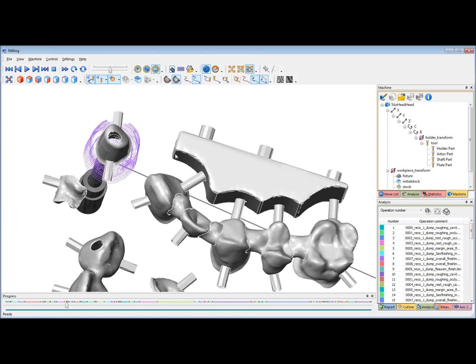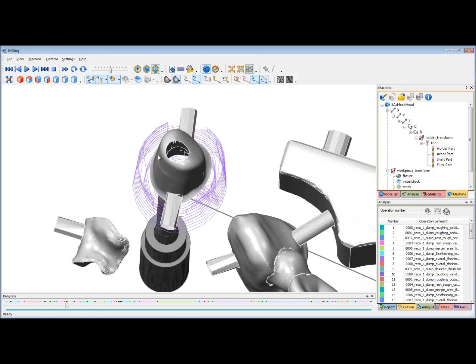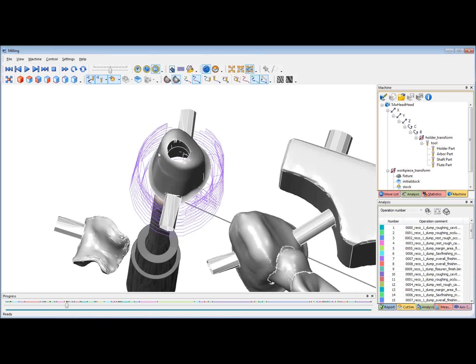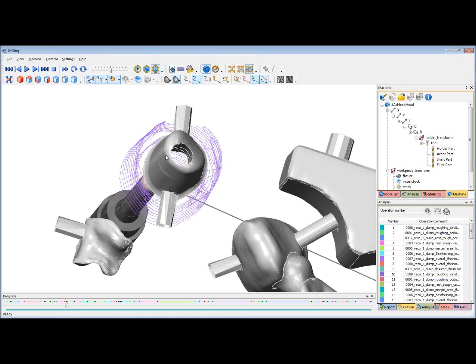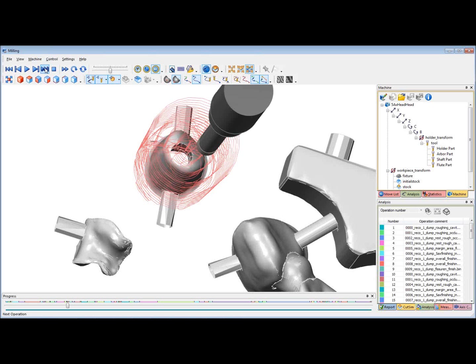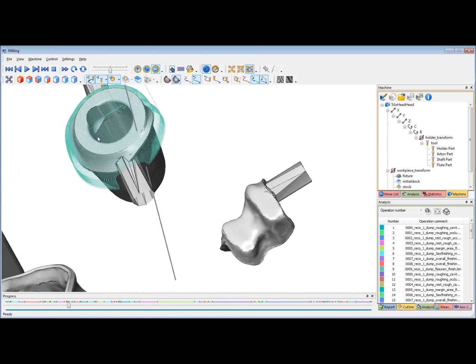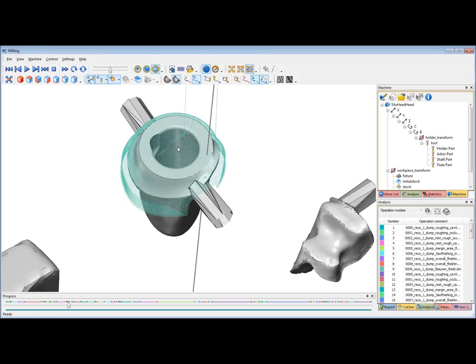Next we have an abutment. This abutment has screw holes which have different insertion directions from the occlusal and cavity side, and these insertion directions are automatically picked by the CAM software, and the toolpath for the screw holes is generated in this direction. So we have the normal roughing, and we have overall finishing on the cavity side. We kept the screw holes so that the tool doesn't plunge into the hole while finishing this.